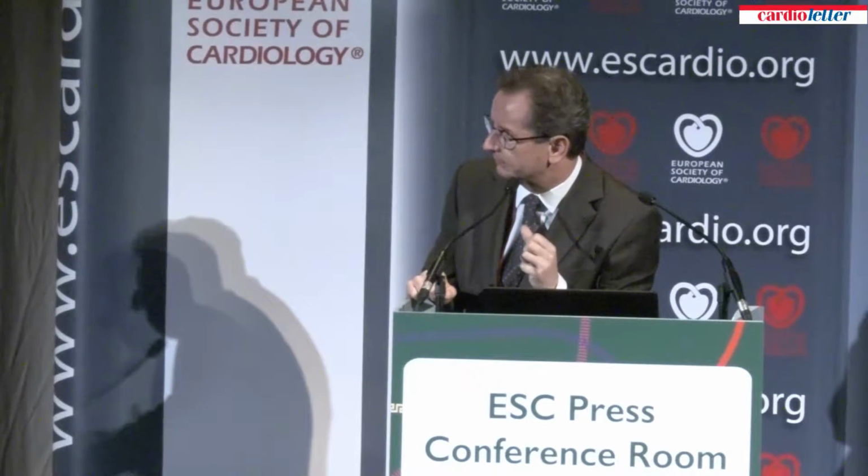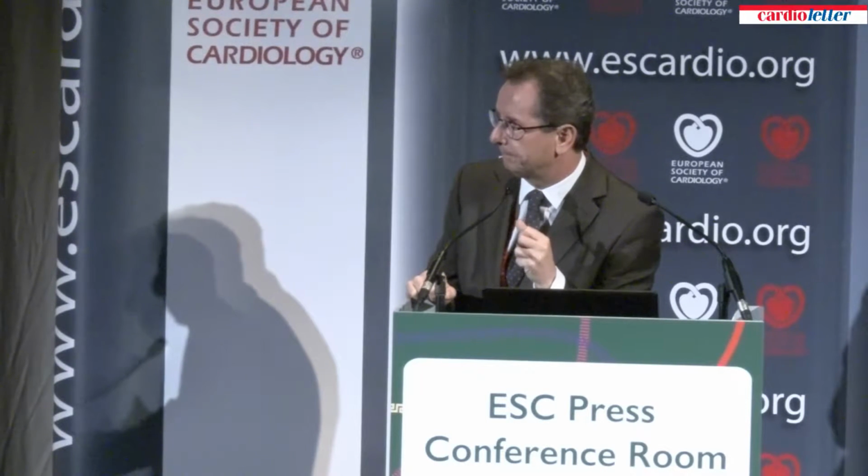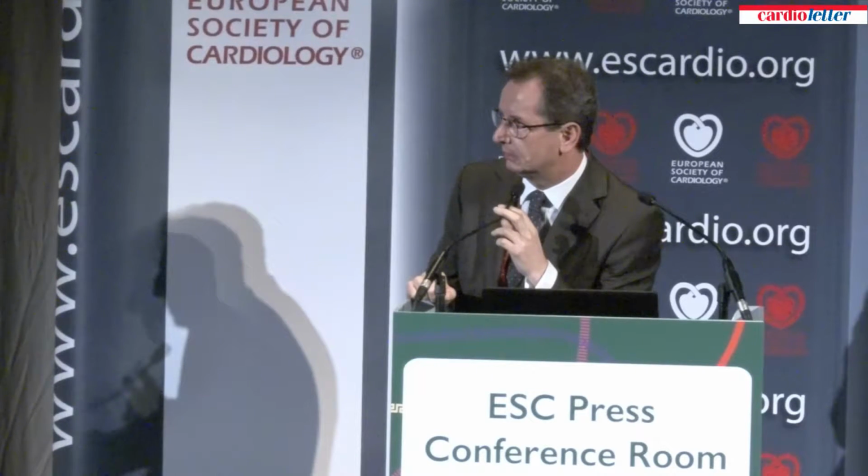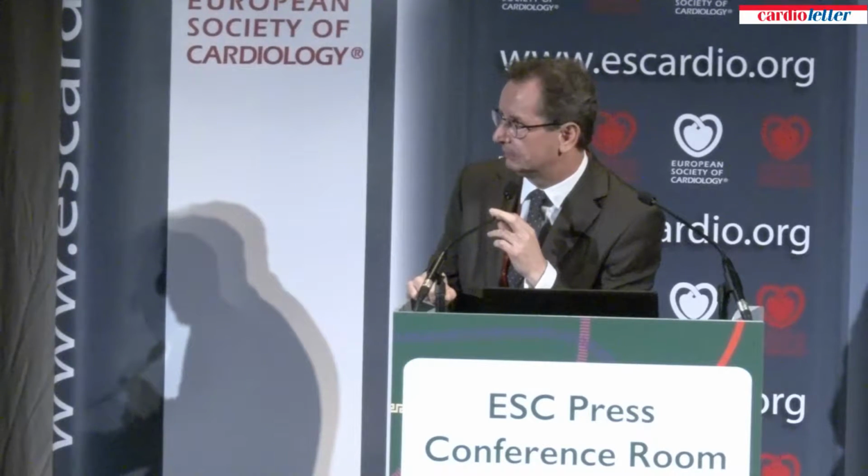I think two comments there. This is Culotte stenting done very well in a single center with obviously very experienced operators. You have 100% final kissing balloon. That's rarely seen because one of the problems technically, a very technical comment, is to get back into the side branch and do the final kissing that defines the final geometrical conformation and coverage of the branches. So 100% shows there are operators there that know what they're doing and they're doing it in a very good way. For that reason, it was very important to do that trial.